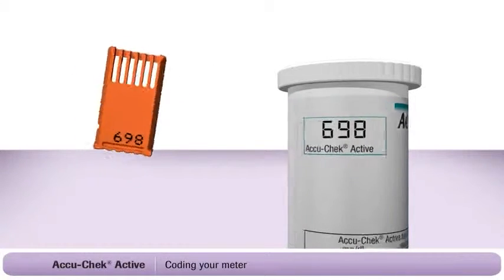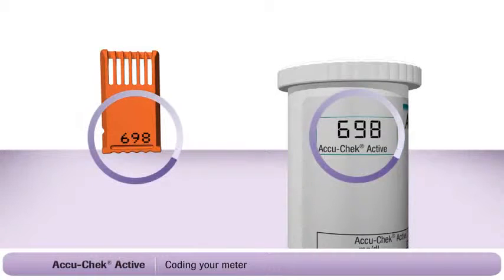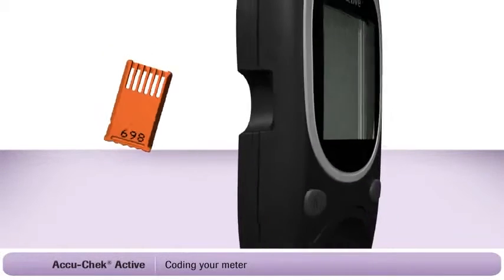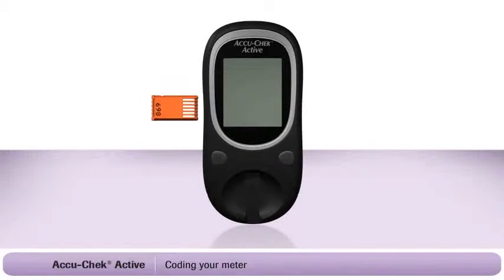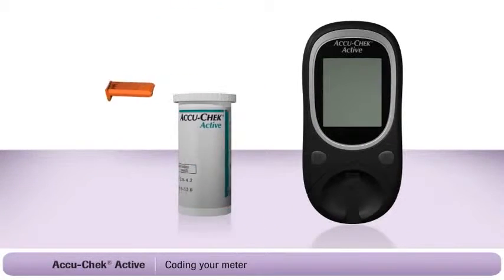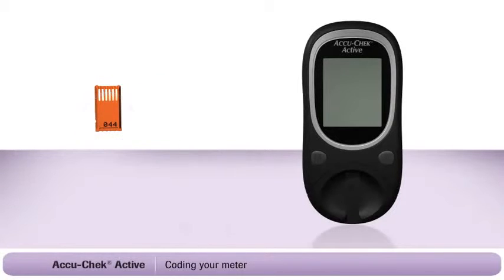The numbers printed on the top of the code key match the code number on the test strip container label. Insert the key as shown into the slot on the side of the meter. Now the meter is coded to use these test strips. Wasn't that easy? When you start using a new box of test strips, it will contain a new code key. At that time, you'll need to remove the old code key and replace it with the new one.